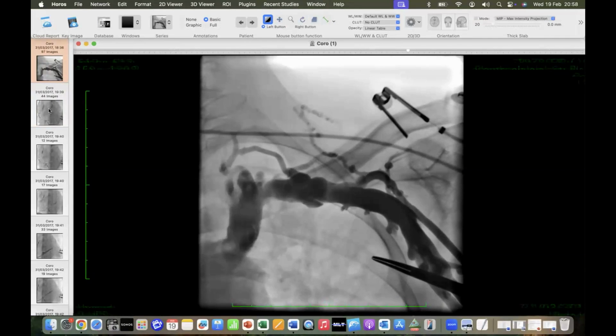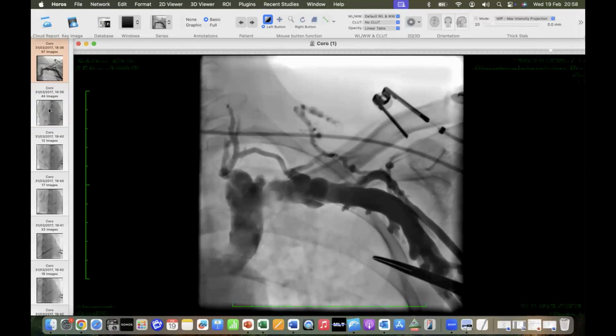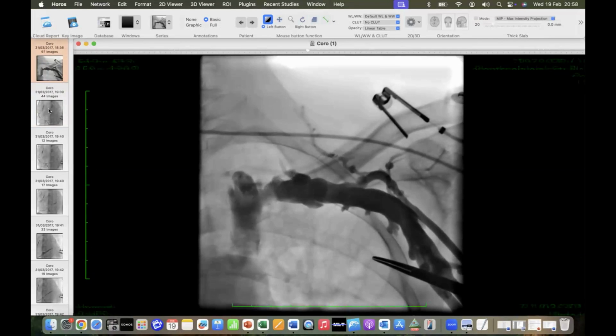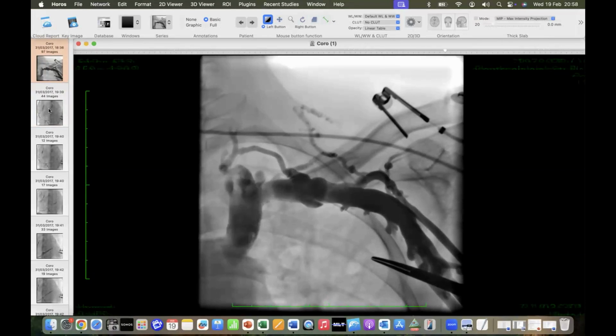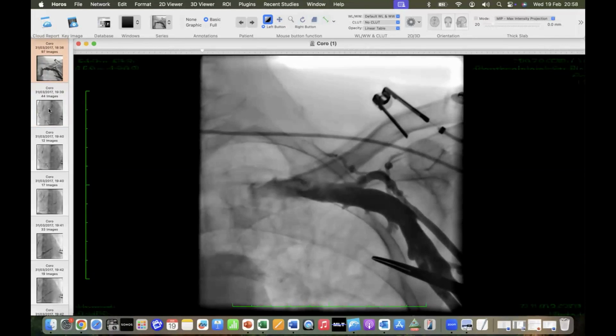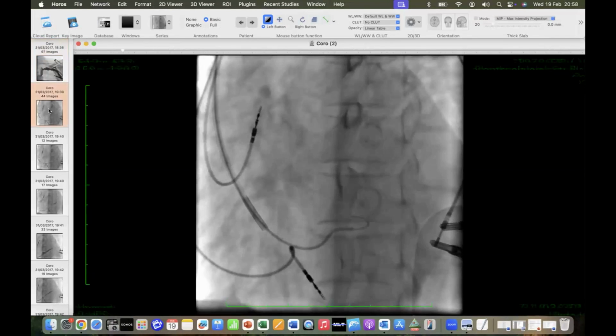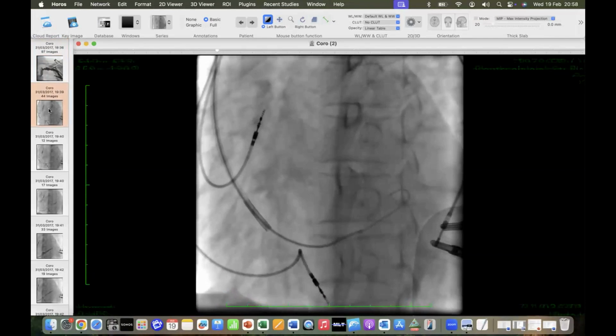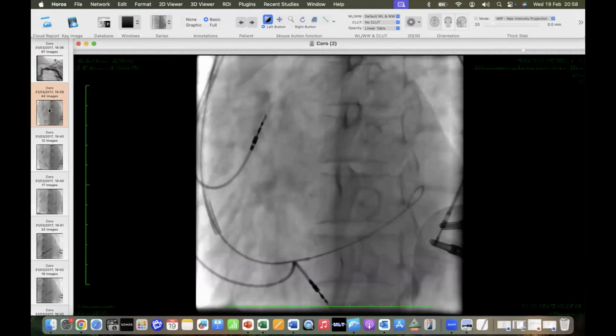Thank you. You can see the new venogram. There's a venogram here of the axillary vein. And as you can see, we've taken a venogram of the axillary vein. We do this as standard, and we do 3 separate punctures. And now I'm going to go straight to the coronary sinus cannulation. This is a technique that Dr. Hasham described. You push an Amplatz catheter.